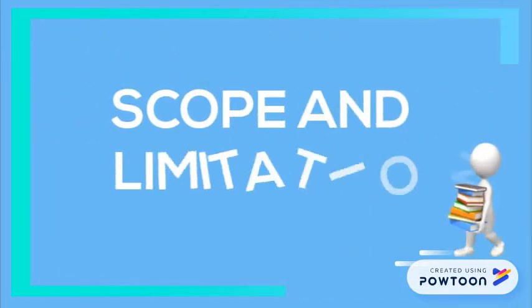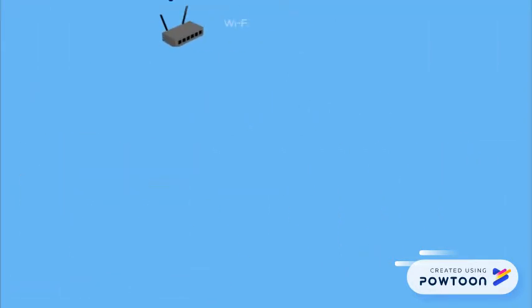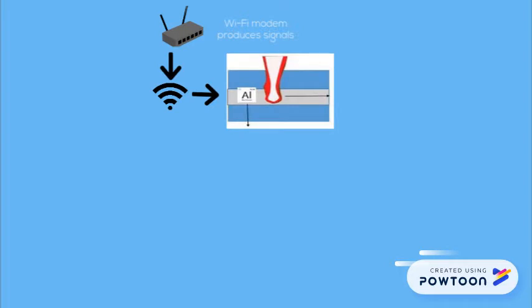For the scope and limitation, the Wi-Fi modem produces a signal. The Wi-Fi signal goes through aluminum to focus the signal. It will decrease the Wi-Fi signal depending on the bone density.